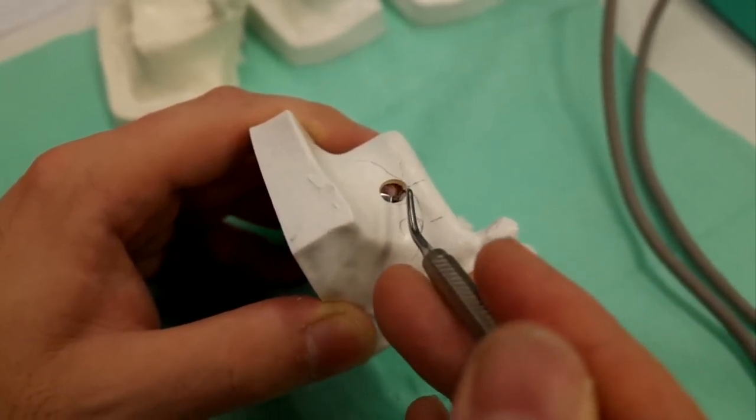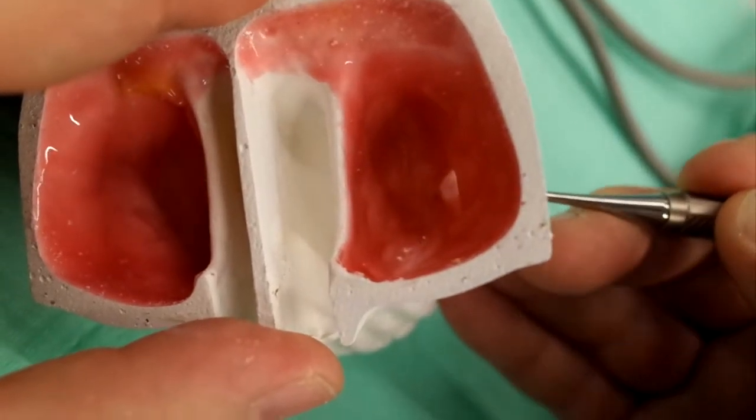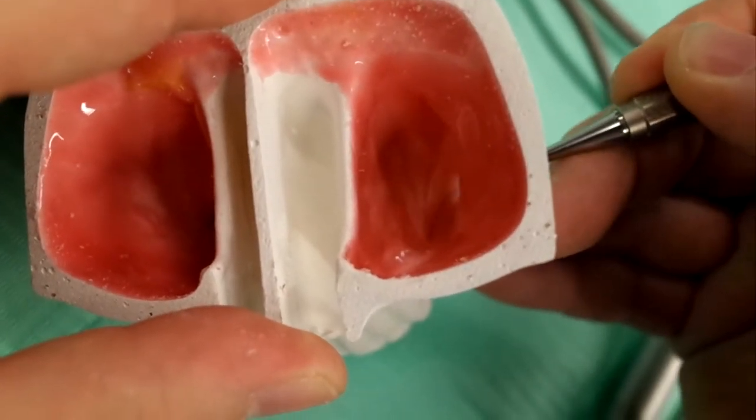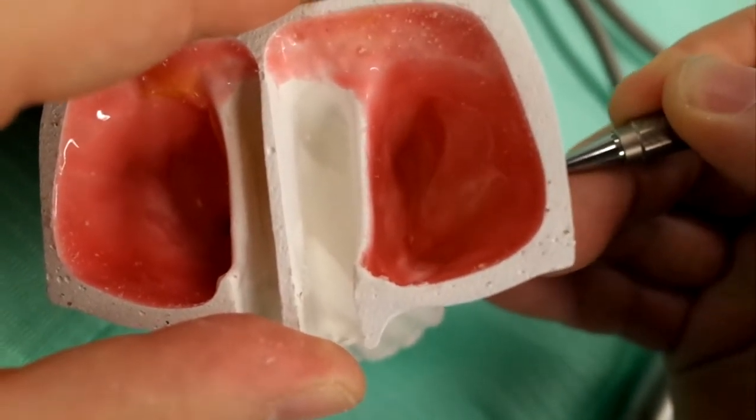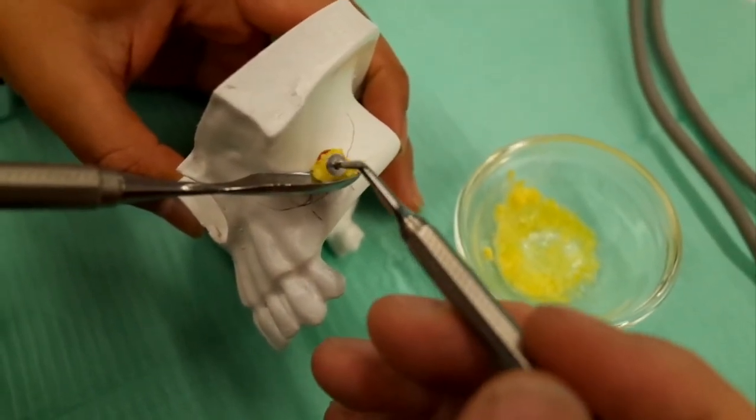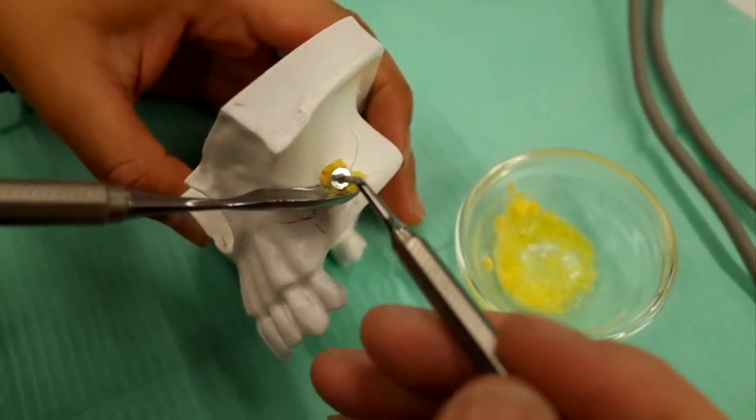Das ist die erste Bewegung. Ich nehme einen Membran-Separator. Und eigentlich mal hier grosse Portion rein drücken. Das ist die erste Bewegung.